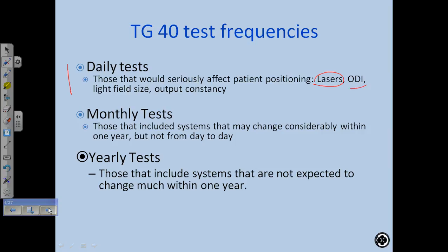ODI, which some places still rely on ODI. That's why they should check it, as a double check, or maybe even as the primary. People set up patients with ODIs. Okay, so do you think an ODI drifts a lot? It probably drifts less than a laser, at least on various machines. I've never seen an ODI be off.